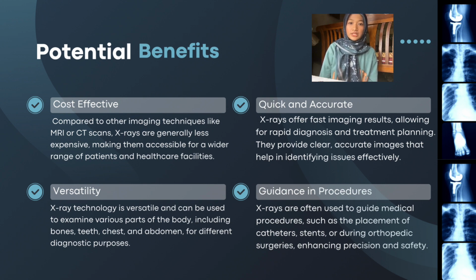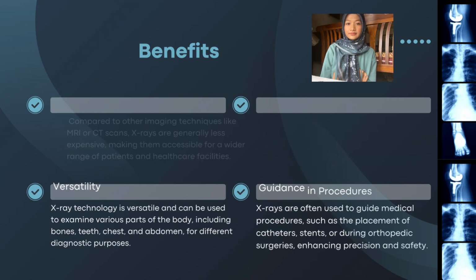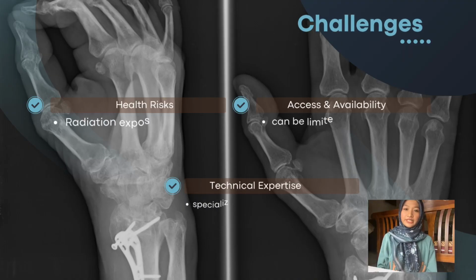Furthermore, X-ray machines play a crucial role in interventional radiology procedures, where they help guide minimally invasive treatments such as angioplasty, biopsy, and drainage procedures. By providing guidance during procedures, X-ray machines enable healthcare providers to perform interventions with greater confidence and efficiency, ultimately benefiting patient care. So, how about the challenges in using X-ray machines?